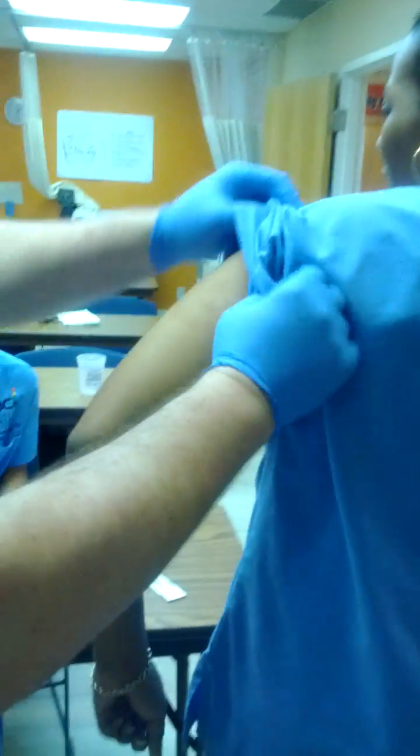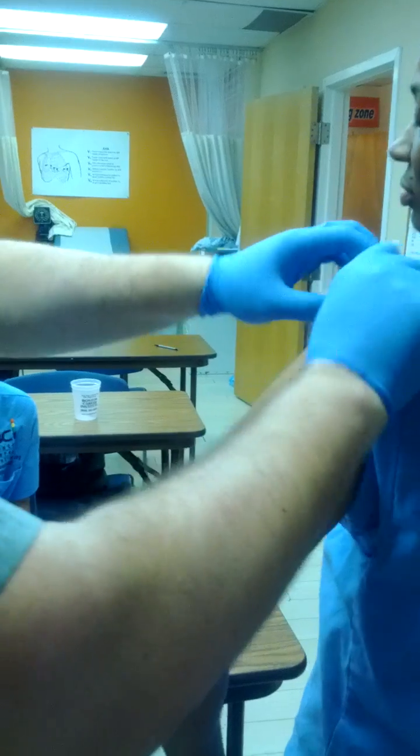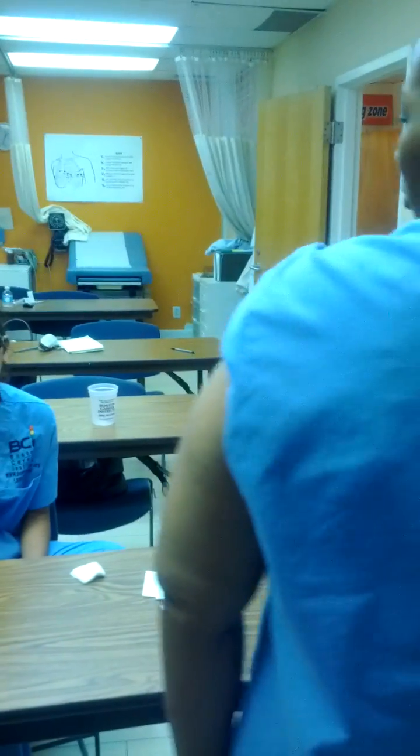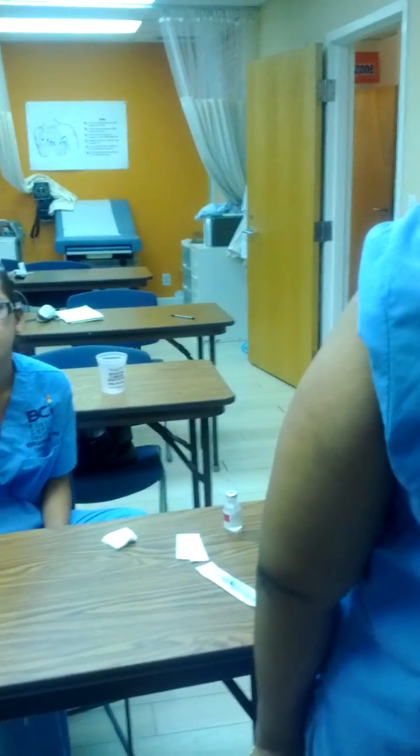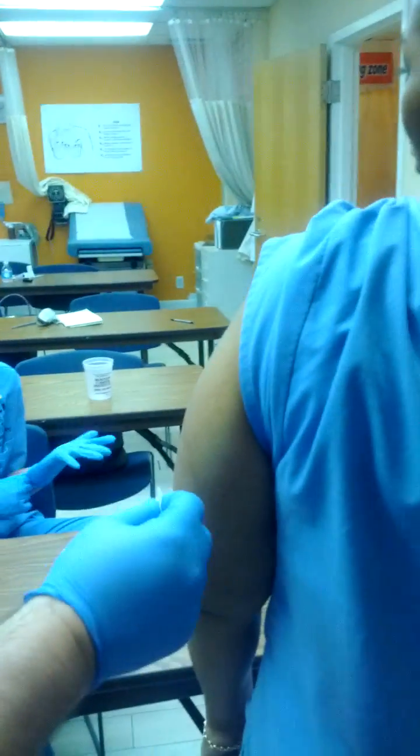We're doing a subcutaneous injection, or the injection into the fatty tissue. We do it on the back of the arm in this particular class, and once again, there must be a written, expressed order from the doctor on paper as to what medication, what patient, what dosage — everything the doctor tells you.